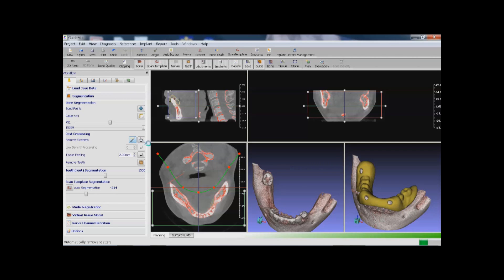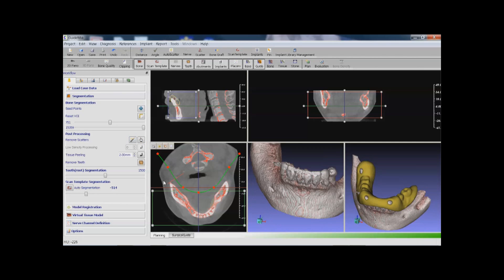Now the bone segmentation is done. In the data preparation panel, there are tabs for registration and virtual tissue model, which we will demo in some other more advanced sessions.